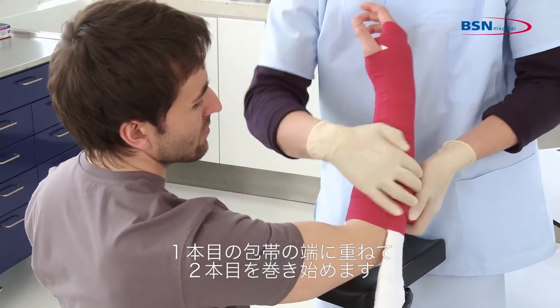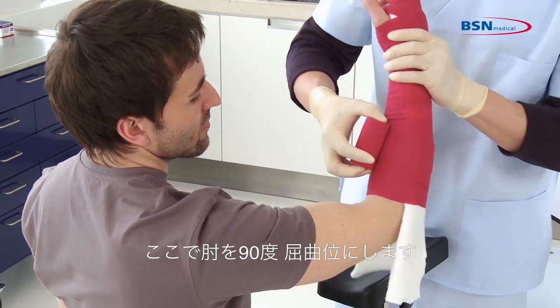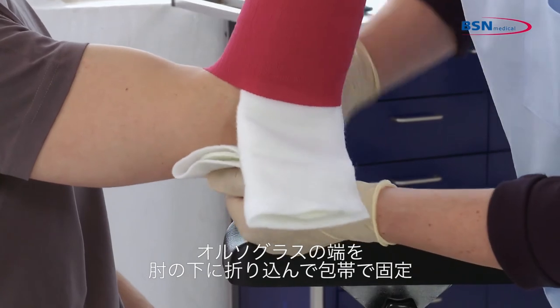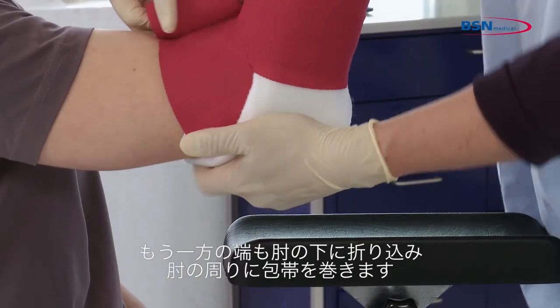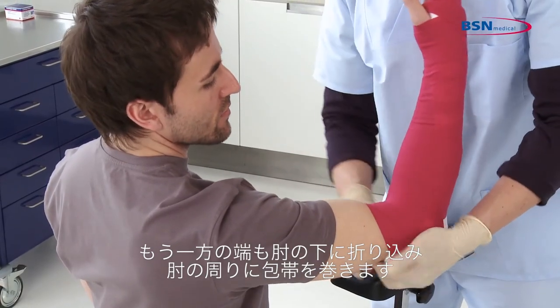Secure the first bandage and start with the second bandage over the end of the first one. Now position the patient's elbow at 90 degrees. Fold one side of the excess material under the elbow and secure with a bandage. Then fold the other side of the splint also under the elbow and continue wrapping the bandage around the elbow.